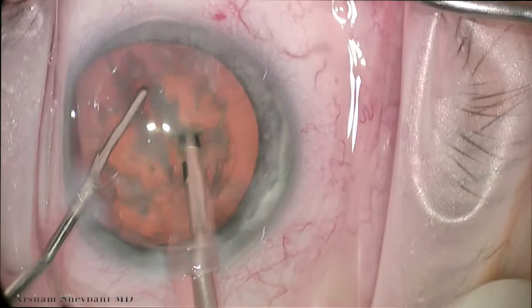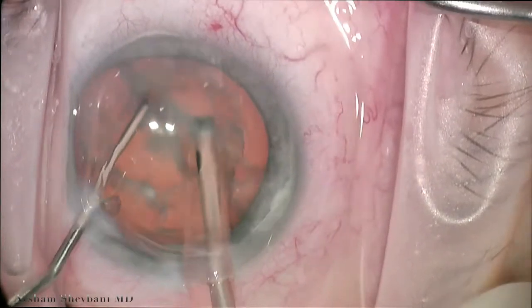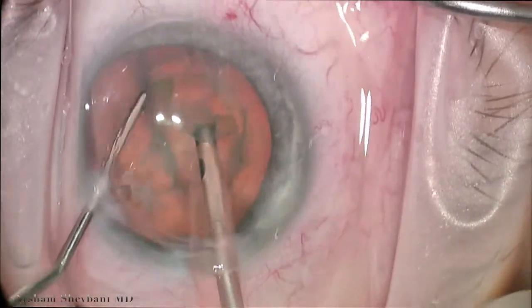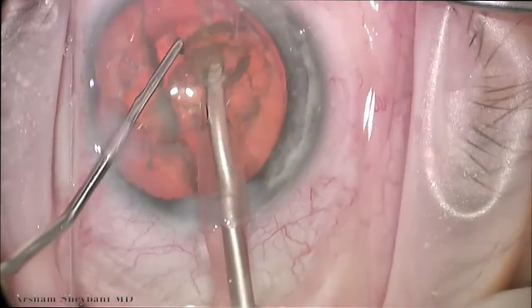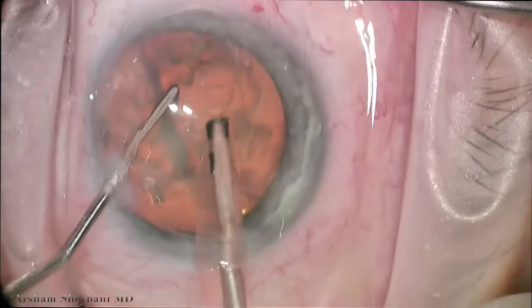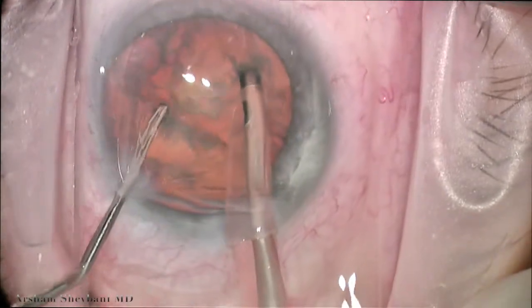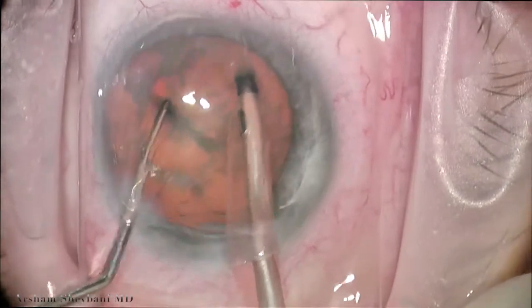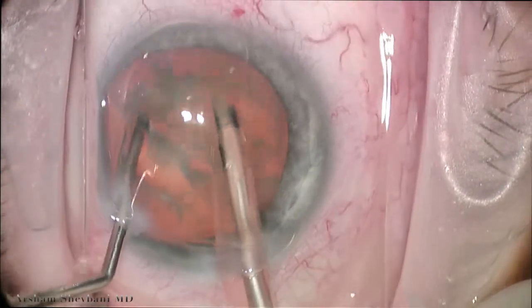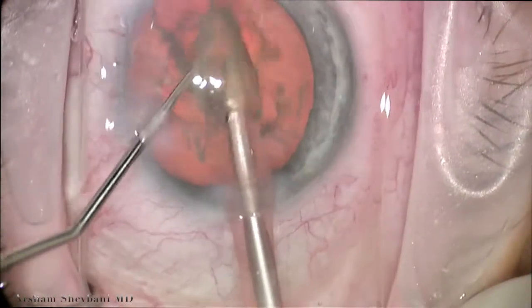We're using a hemiflip technique after we make our initial chop — we take out the hemiquadrant at a time. This chopper is great for elevating pieces as well as performing vertical and horizontal chop maneuvers. It's bladed a little wider, so it can rest against nuclear fragments a little easier for divide and conquer surgeons as well.